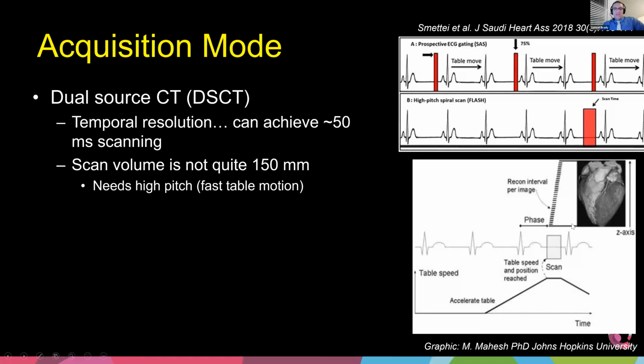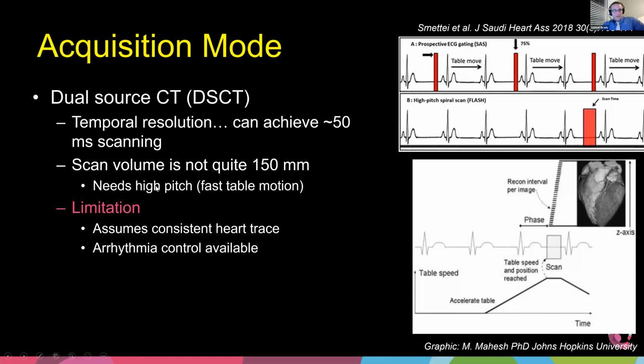With the newest scanner, they have what's called the turbo flash.